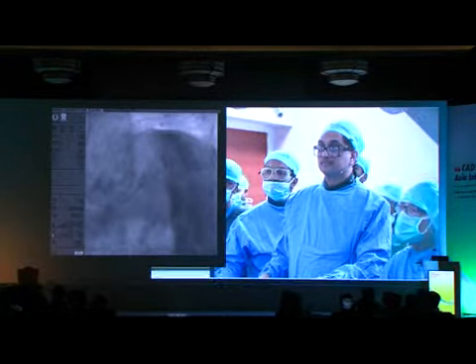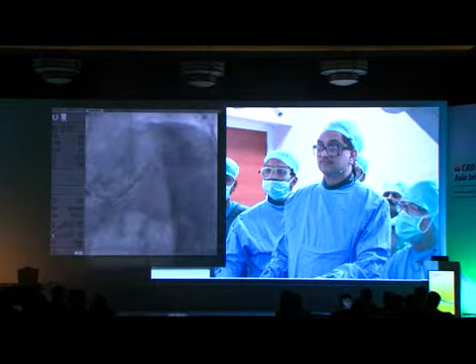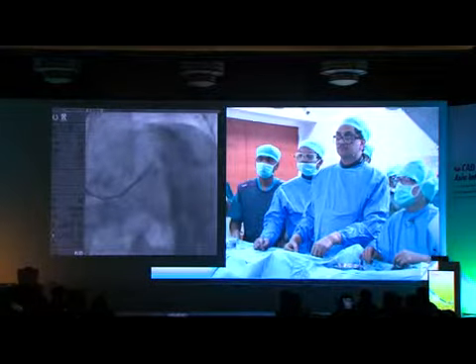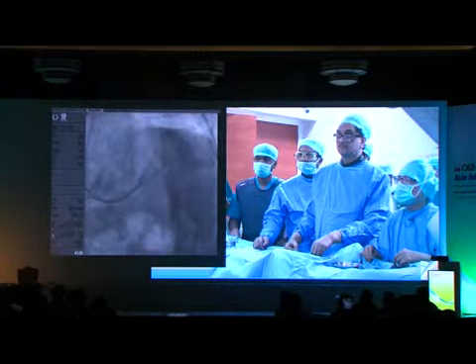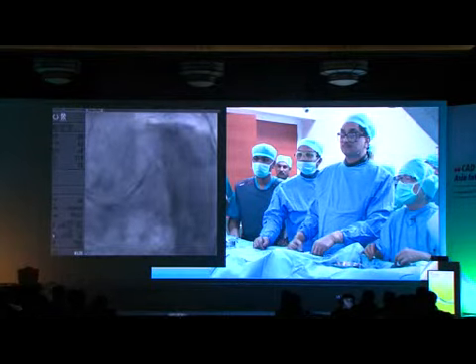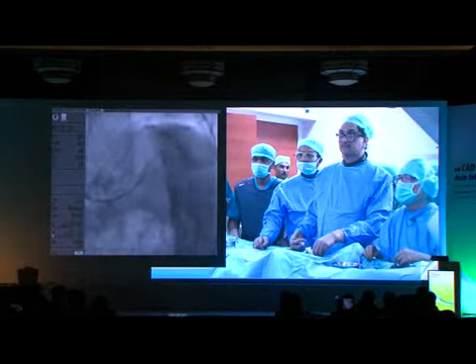So I'm trying to enter. Okay, I think it's exactly here. Now we have to find our way gently.